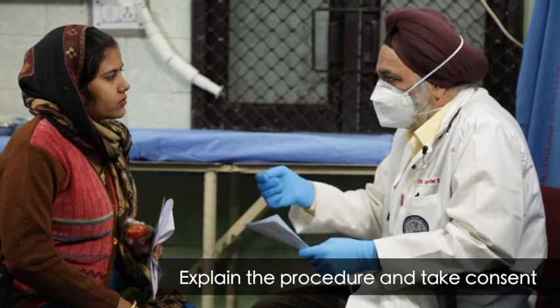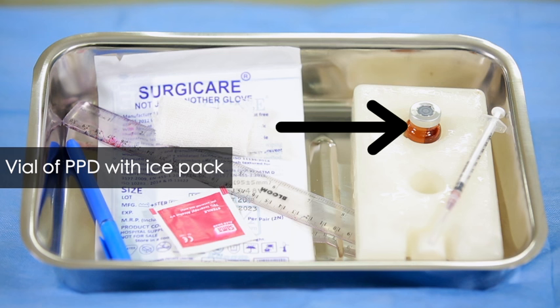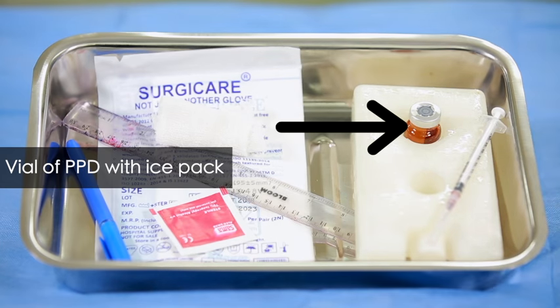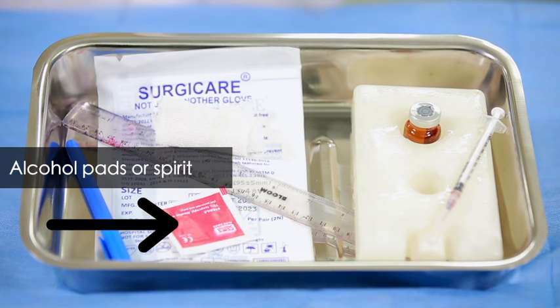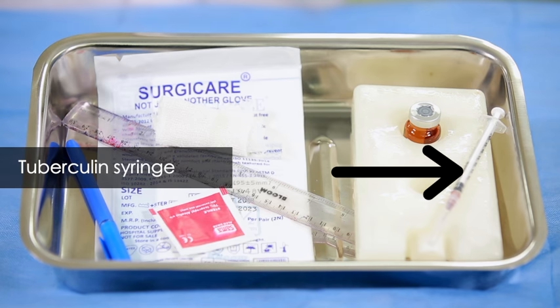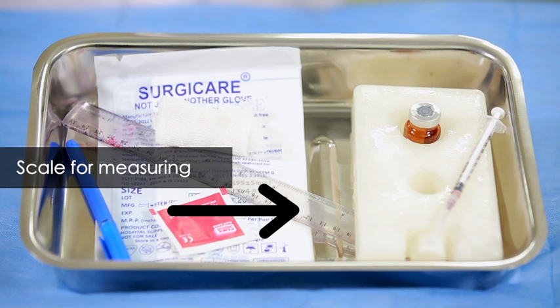Explain the procedure and take consent from the parent or guardian. Instruments needed for the procedure are: a vial of purified protein derivative (PPD) with an ice pack — this is to maintain temperature between 2 to 8 degrees — sterile gloves, alcohol pads or spirit, tuberculin syringe, 27 gauge needles, sterile gauze, ballpoint pen, and scale for measuring.